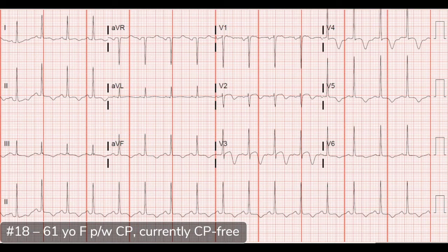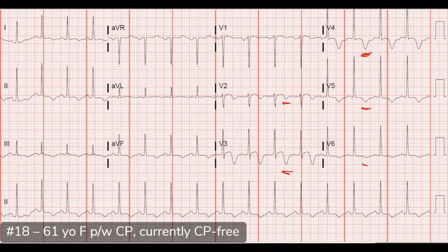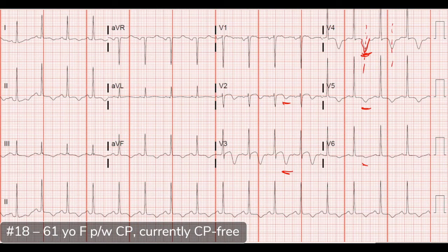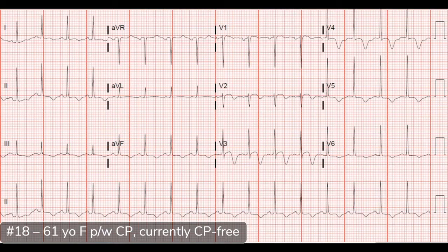The key findings are ischemic changes. Looking at V2 and V3, there are biphasic T waves — an up-down motion. Continuing laterally into V4, V5, and V6, we see inverted T waves that are symmetric — drawing a line down the middle, they look pretty even on both sides. These continue on the inferior leads as well, with T wave inversions there too.